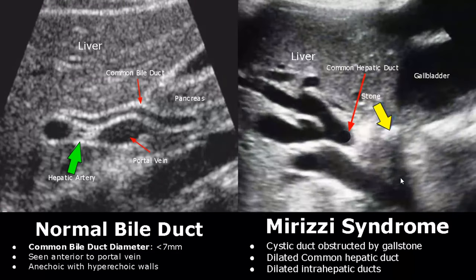Mirizzi syndrome refers to compression of the extrahepatic bile ducts due to stones either in the cystic duct or the gallbladder. Here we can see a stone in the cystic duct causing obstruction and also compressing the common hepatic duct, which led to dilated hepatic bile ducts.